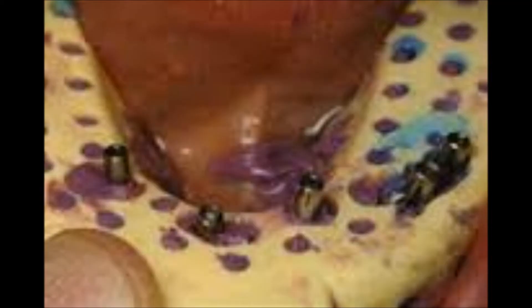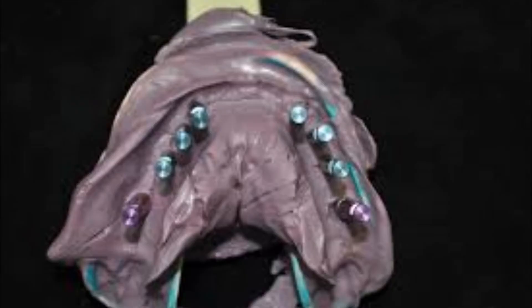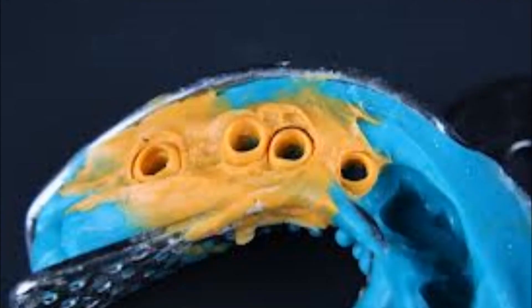Standard disposable trays aren't resistant enough to withstand pressure. Shortly after the impression's removal from the mouth, the walls of the plastic tray bounce back to their initial state, resulting in deformation of the impression. Although the deformation cannot be seen with the naked eye, a simple visual inspection reveals contact between the tray, the muscles, and the tongue — in these places the impression deforms most.